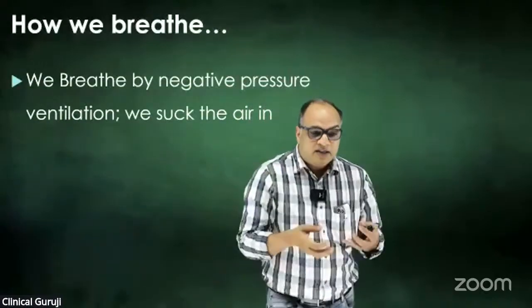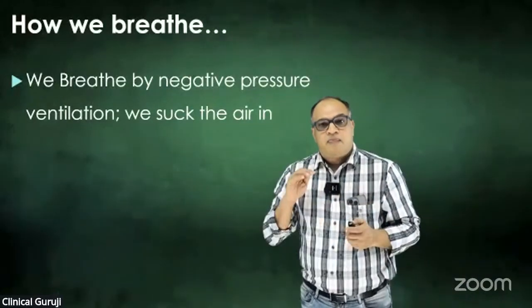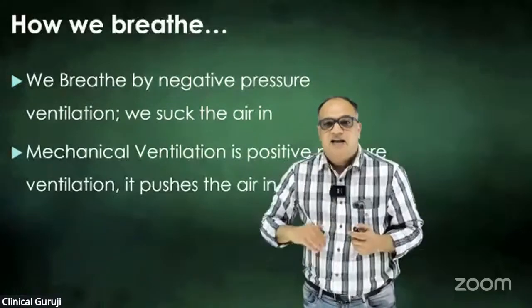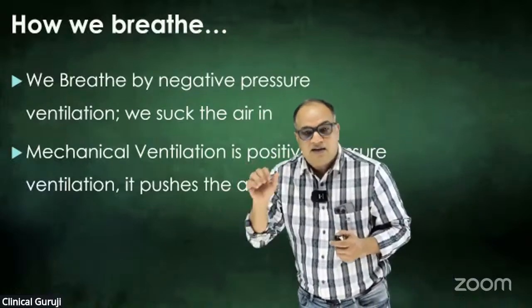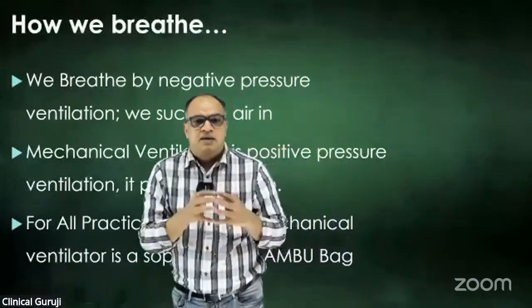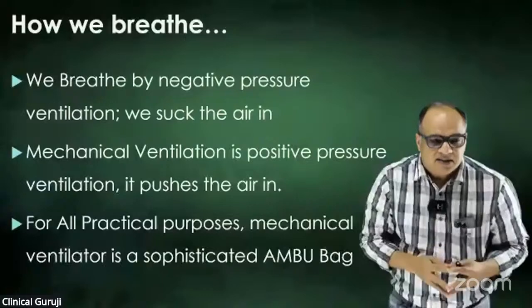Again, coming to a little basics, how we breathe. We breathe by taking in the air. Whenever you put a stethoscope and you say, "Baba, ek lambi saans kheecho." When we breathe naturally, we suck the air in, it is called negative pressure ventilation. While mechanical ventilation is exactly ulta. It is positive pressure ventilation, it pushes the air in. So for all practical purposes, mechanical ventilation is a sophisticated, educated ambu bag, nothing else.